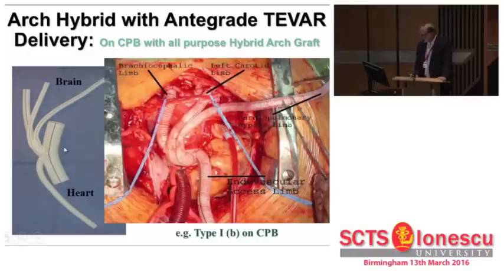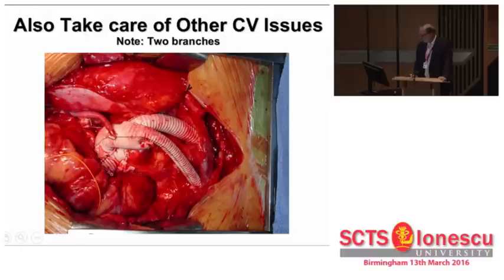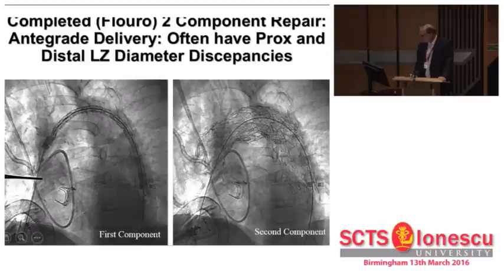This is an antegrade graft that we use. In this particular case, we cut off the ascending aorta part of it and then just come in with either a two-branch or three-branch graft with an antegrade access delivery arm for these hybrid procedures. This is a pre-made graft with a large innominate 12-millimeter graft, 16-millimeter inflow. So also for pump, to put him on the pump, we can do coronary bypasses or even AVRs or other things that also occasionally need to be done.